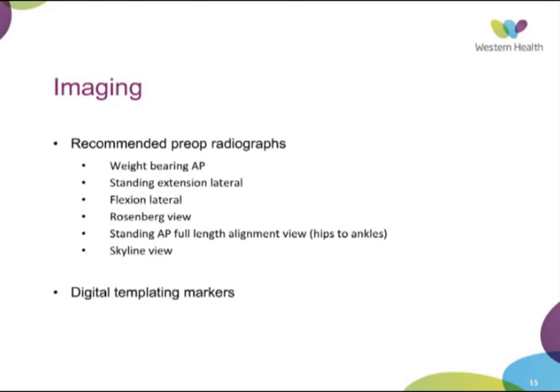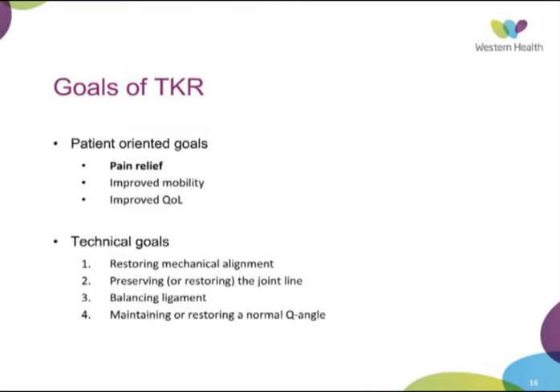The recommended preoperative radiographs are pretty standard, with AP and lateral views. Now, it is recommended that patients have a standing AP full leg alignment view to help with the planning. It's not something that I guess we see everyone doing, but it is something that is probably recommended. And in the modern day and age of preoperative planning, using digital templating markers to help scale our x-rays for digital templating programs is becoming more and more common. So our goals for total knee replacement is what we're trying to achieve for our patients.